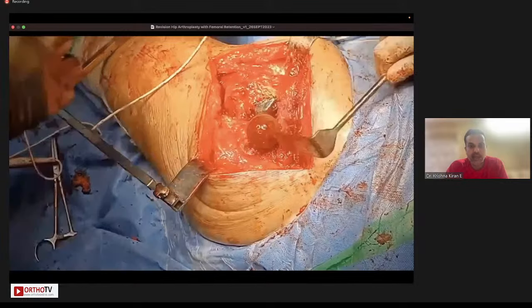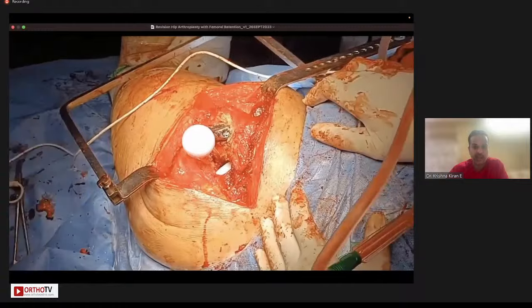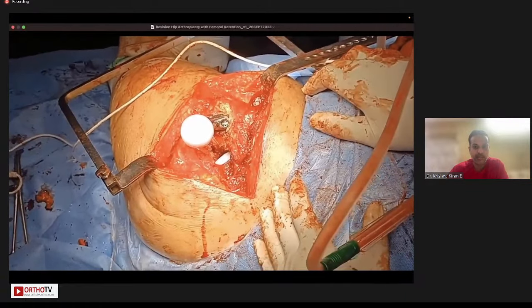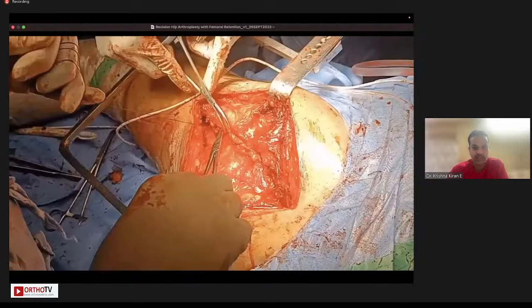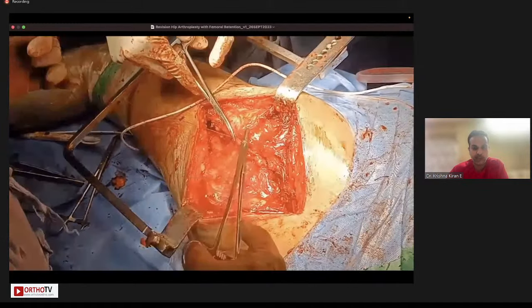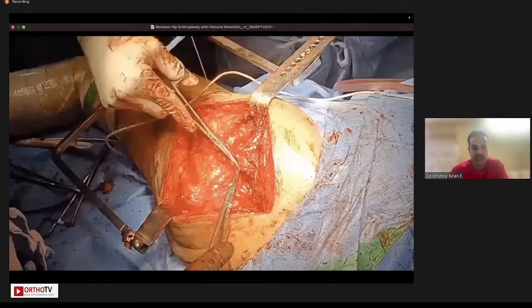Ideally, you would put in an option sleeve adapter on the femoral component and a ceramic head. And because the option head was not available in this particular case, we used a ceramic head. Once that is done, the entire posterior tissue, as you can see, can be closed back because we have not violated the edge of this flap.